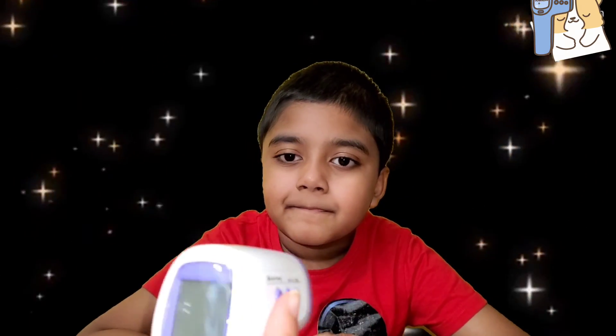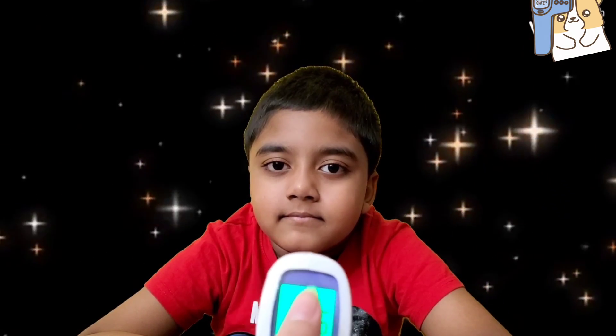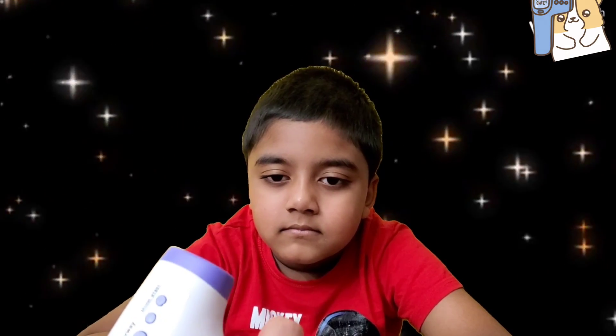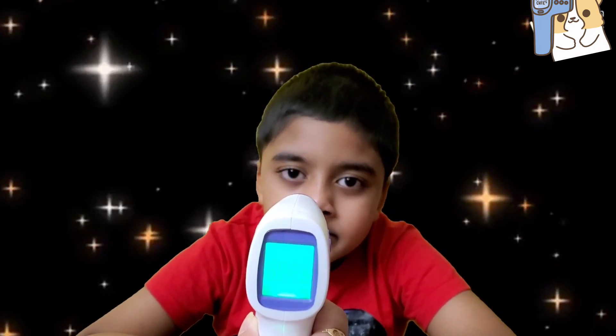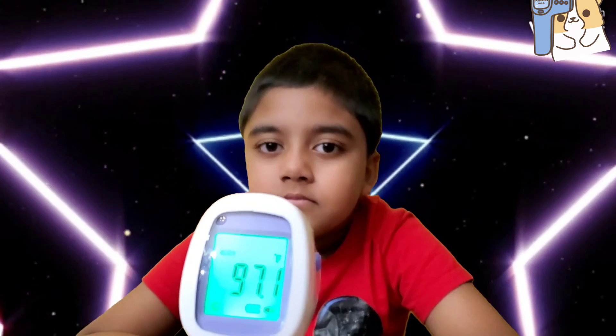Now I'm actually going to demonstrate this on an actual human so you can see how it's done. I have it set on 'body' — you can get to that by pressing 'set' — then I press the trigger and point it at him, and there you go: I got a 97.1.